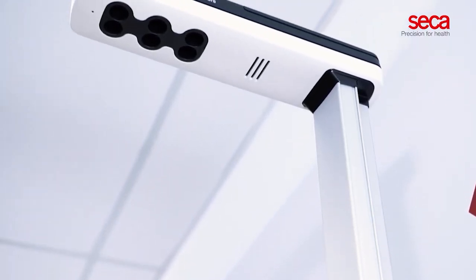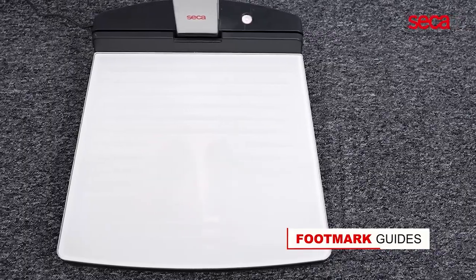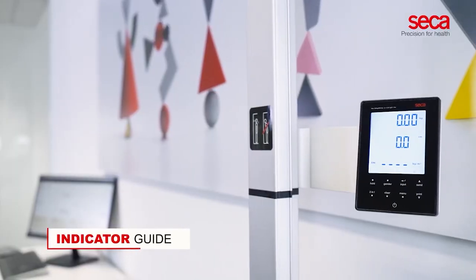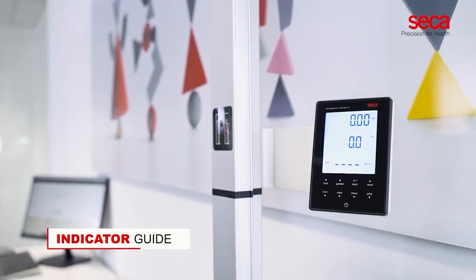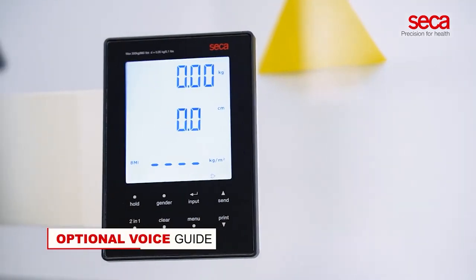The ultrasonic device is user-friendly, with foot-marked guides on the platform, an indicator guide on the column, and an optional voice guide. Patients can easily utilize it without any assistance from medical personnel.